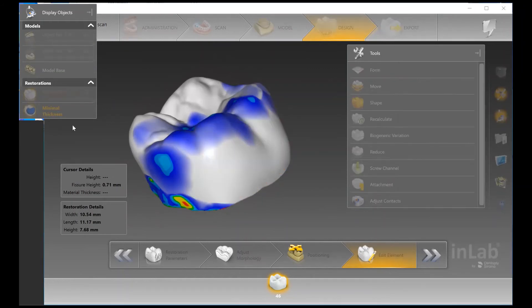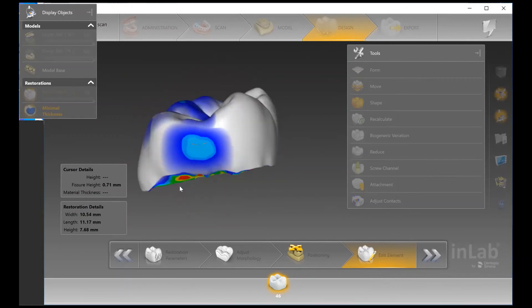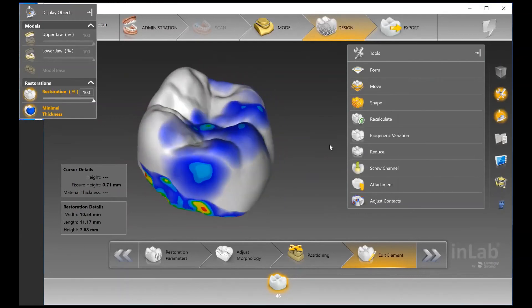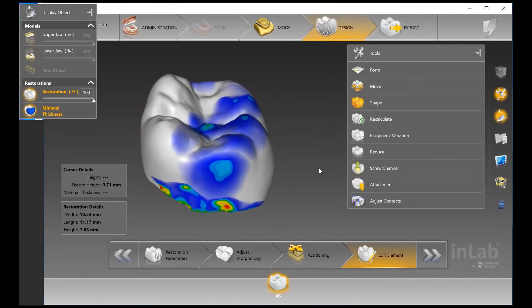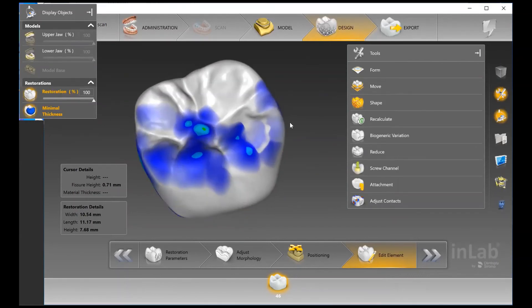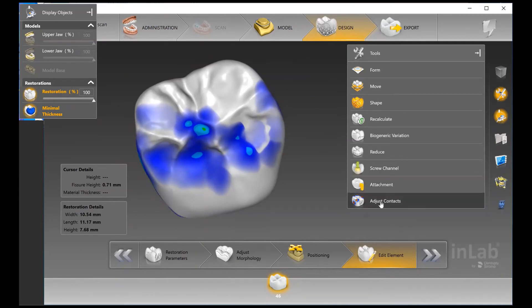I'm not going to use the Reduce Tool in this case because I'm using Cercon XTML, which already has really nice incisal translucency and gingival third staining. But it's nice to have that option.